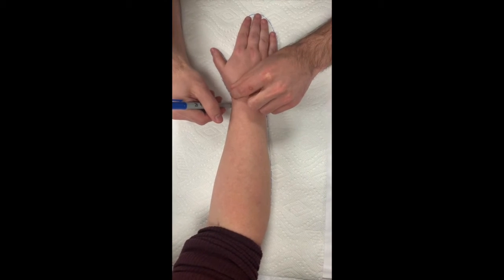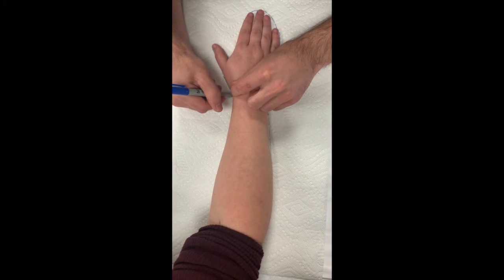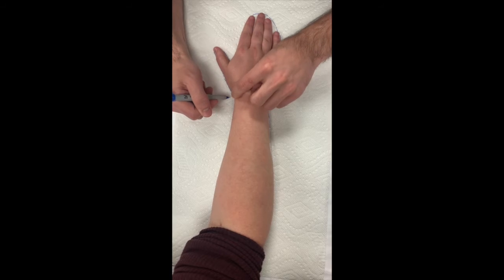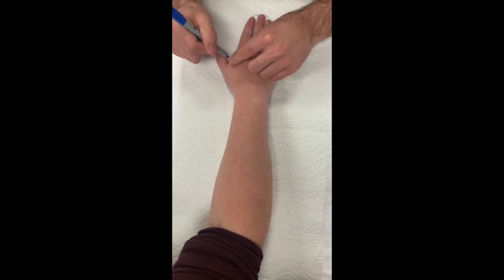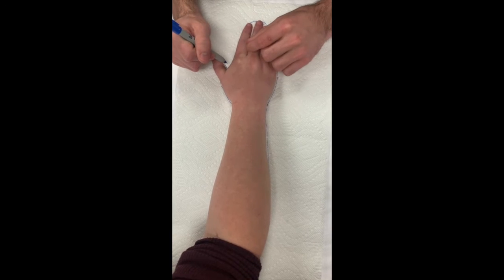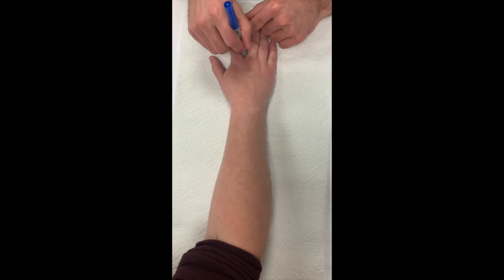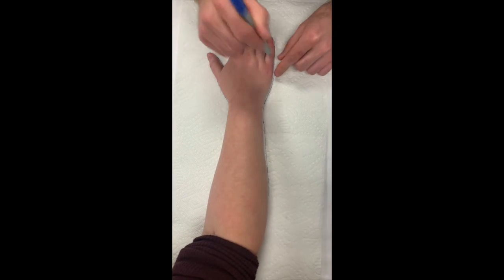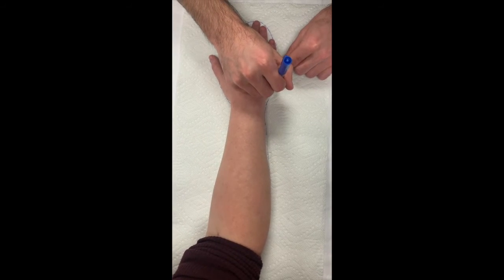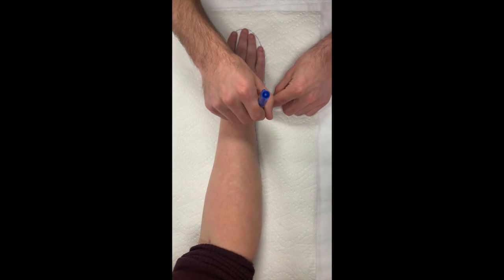Mark the following landmarks: radial styloid, CMC joint, thumb web space, proximal to the second MCP joint, in between the second and third web space, proximal to the fifth MCP joint, and the ulnar head.